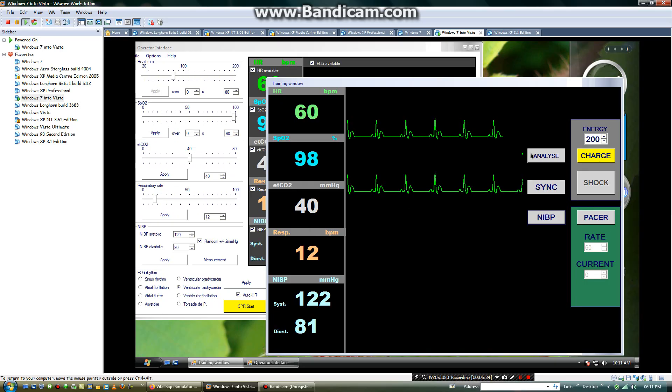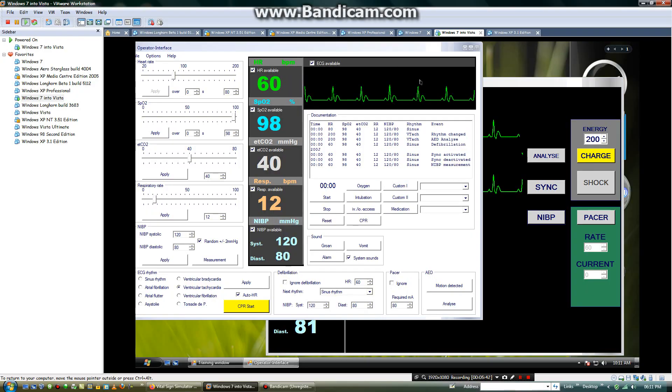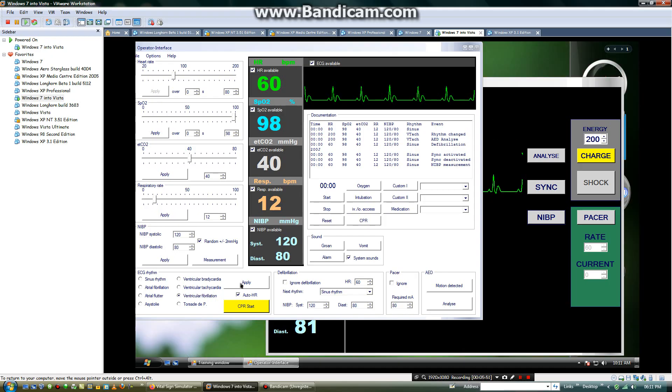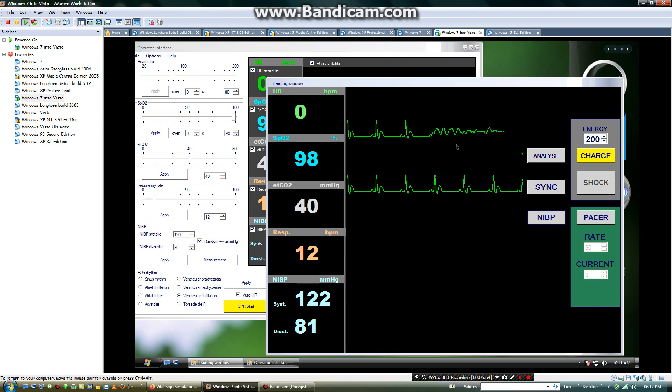And this will prompt you to start defibrillator. Now what we need to do is to change the heart rhythm to ventricular fibrillation. Then it should appear in ventricular fibrillation. You can see the rhythm is changing.